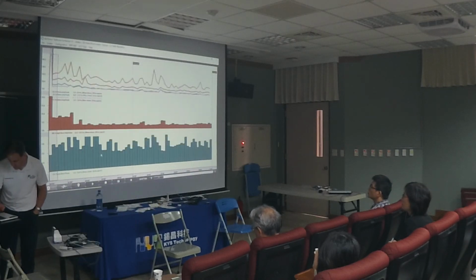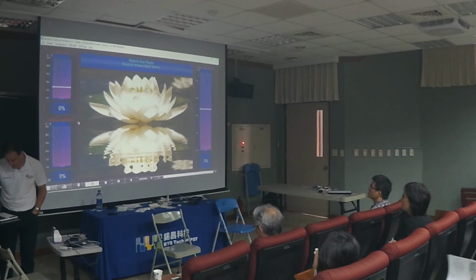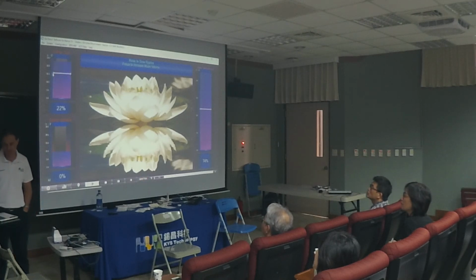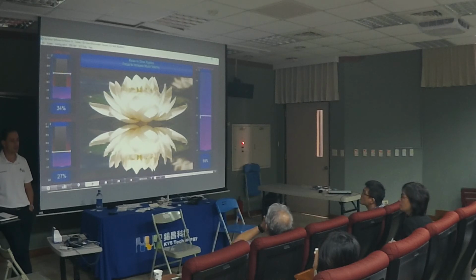We go back to the session, and let's do a replay, and the session is working, right? So the theta you set up at, let's say 16, right? And then the high beta you want to set up at, I don't know, I start at 10, sometimes I start a little high, and here's for the SMR. The SMR I'm going to do at 2. And that's how I start.